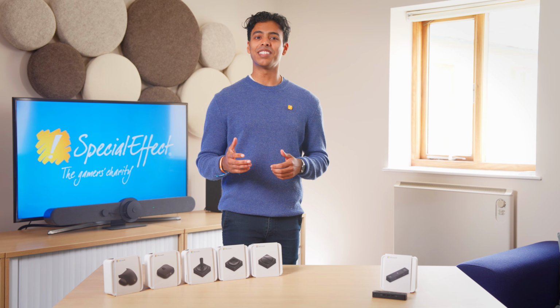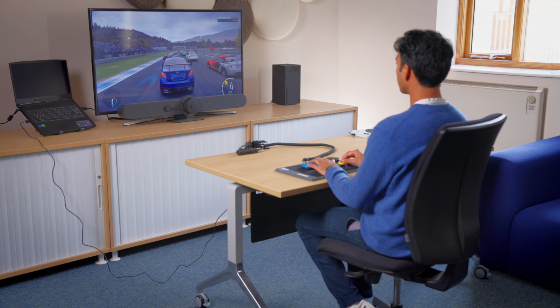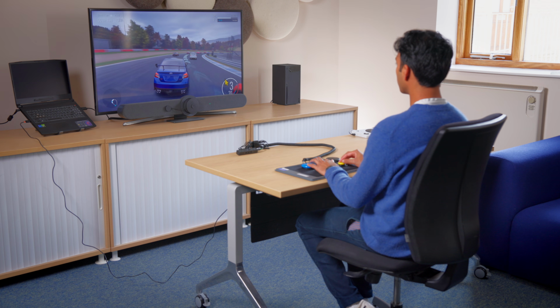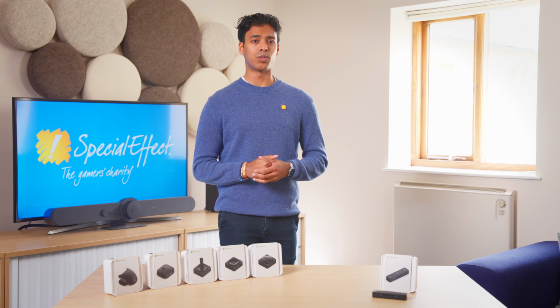After the initial connection, the hub will automatically switch between wired and Bluetooth mode, depending on whether it's plugged into the PC or not. Bluetooth allows you to press switches without needing to worry about cables. This can be useful if your PC is very far away, or if you want to minimize wires, such as when using it as a head switch.